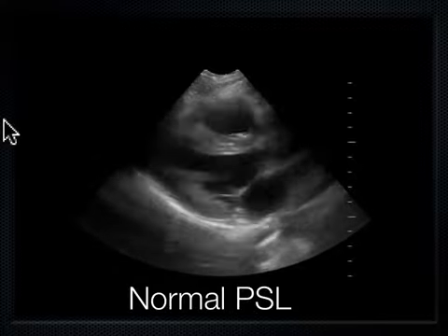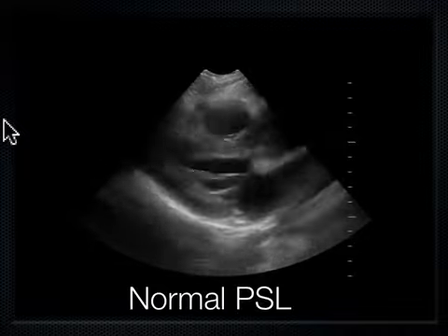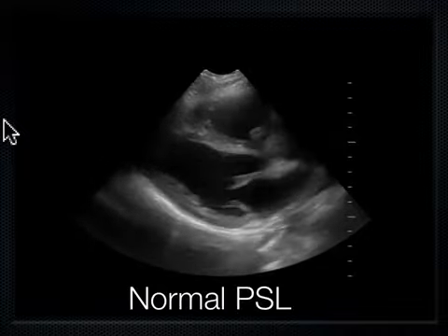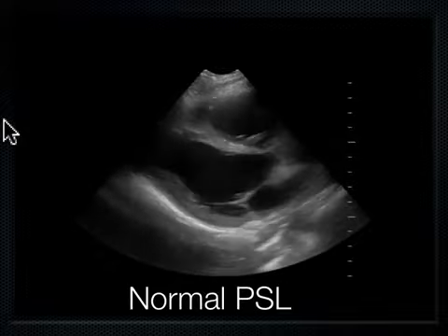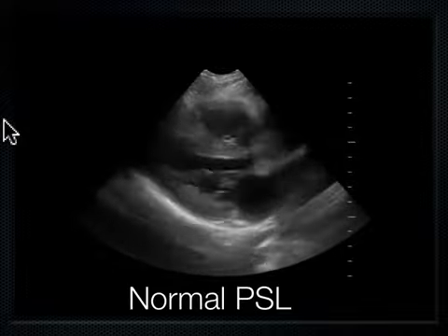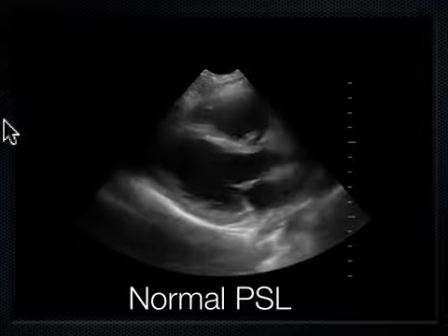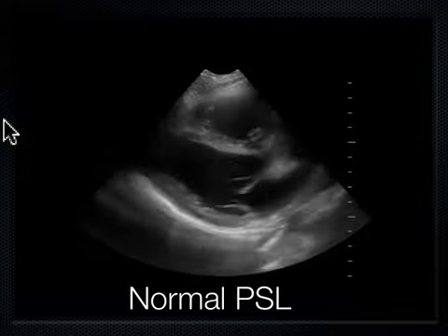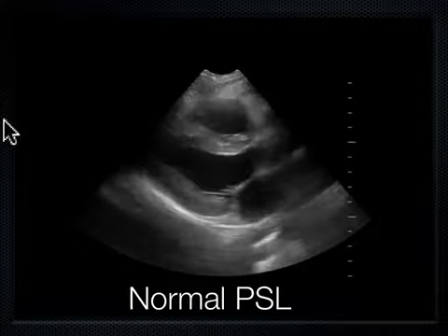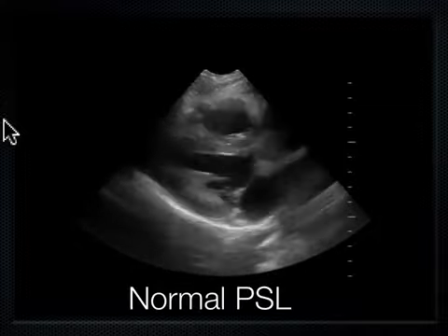And so what I do clinically is if I have a patient who's got hypotension, I am trying to resuscitate them, and I break hypotensive patients down into, do I give them fluids? So if a person comes in my ER, their blood pressure is 70/40, how do I get their blood pressure back up? I can give them fluids. That's kind of my knee-jerk response. And if I saw a normal functioning left ventricle like this, yeah, I could safely give this person fluids. And that would probably fix their hypotension.